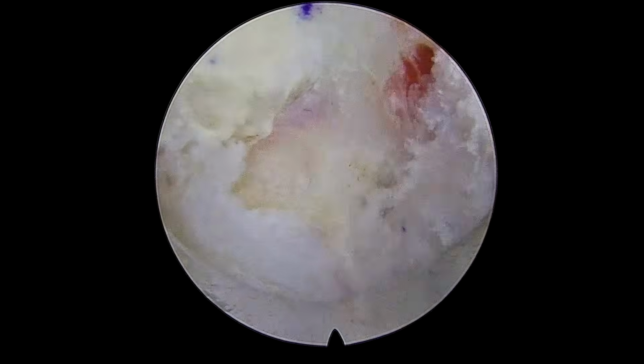So we have thinned out the lamina. I'm going to use the side protection burr for the fine tuning.